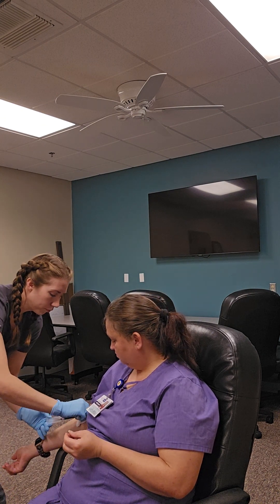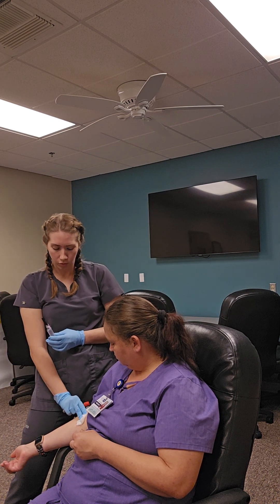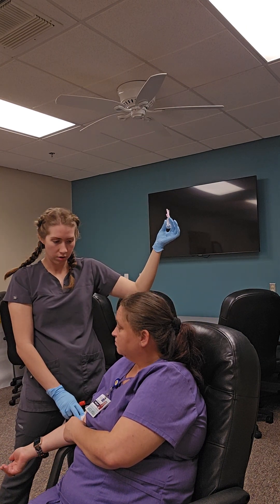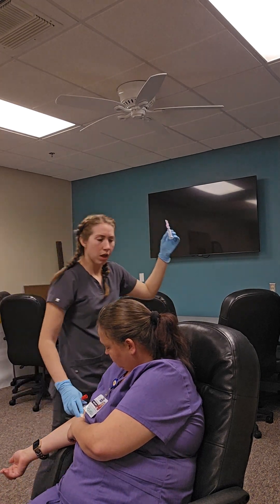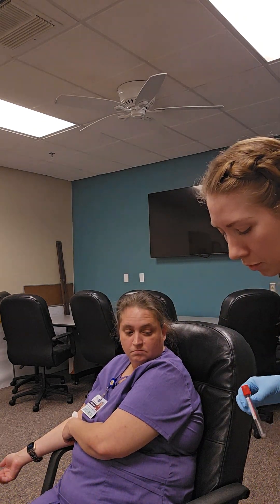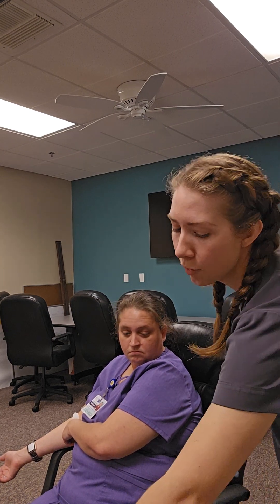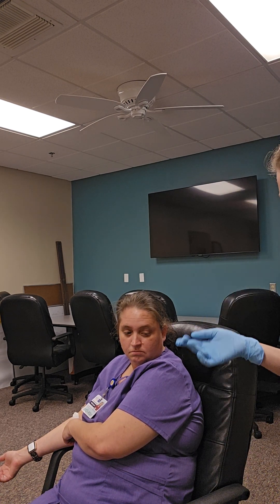Pull the needle out and apply pressure for about 30 seconds to a minute. The patient can usually take over and hold that, or if you have an assistant, they can do it too. After you do that, activate your safety shield and put the needle in a sharps container immediately. Do not recap needles, because that puts you more at risk for an accidental needle stick. While they're holding pressure, I like to label my tubes: first name, last name, date of birth, draw site — that would be her left antecubital — the time of the draw, and my initials. We also have pre-filled labels, so the only things I'd add are time, initials, and draw site.